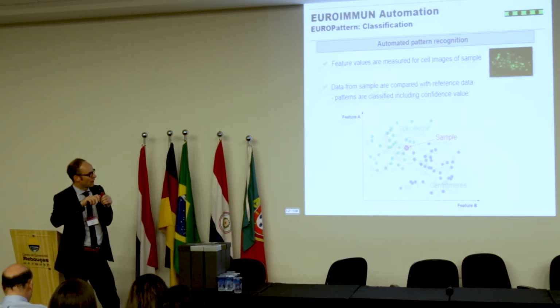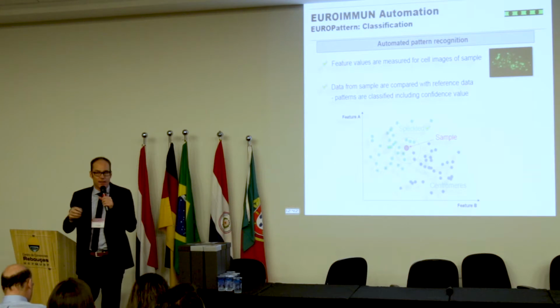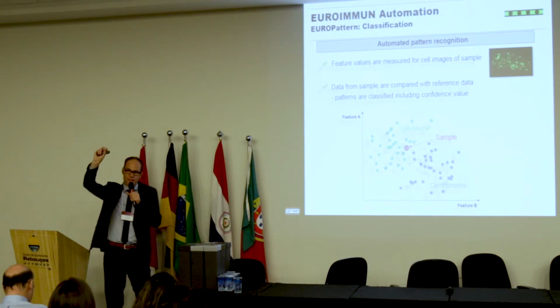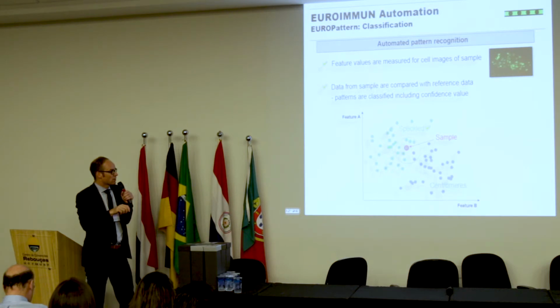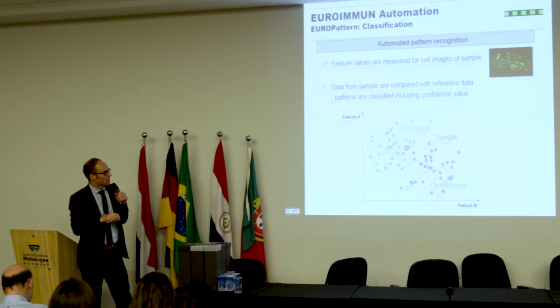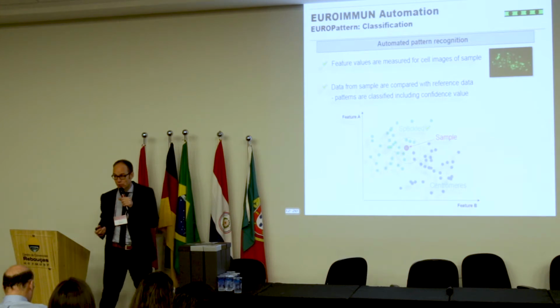So we have a cloud for centromere, and from our speckled reference images, we have a cloud for speckled, and then we just put your sample in these clouds and see what are the 9 nearest neighbors. And in this case, you see your sample has 7 green, so speckled points here, and 2 blue, which are from the centromere cloud. So your sample seems to be more speckled than centromere.